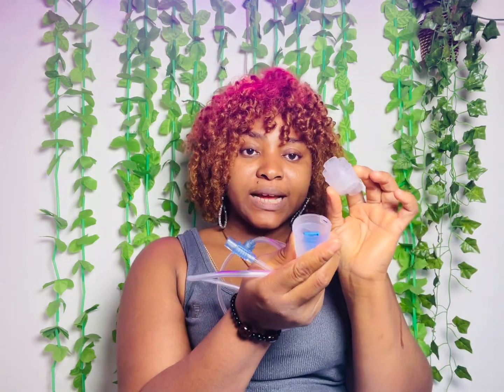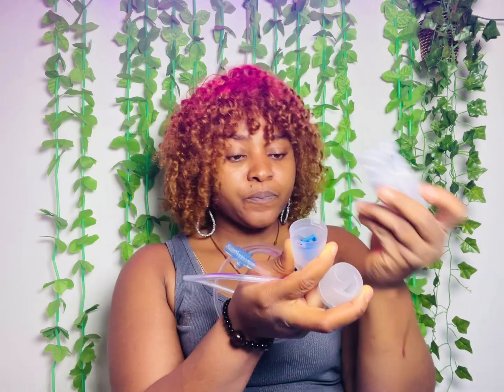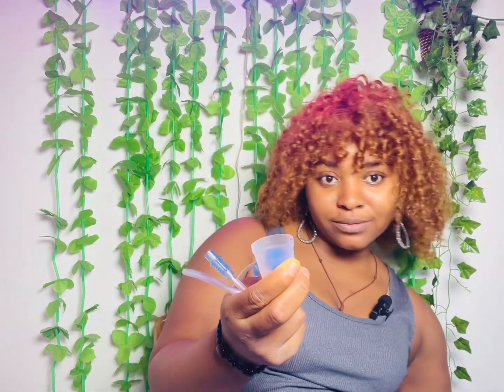When you're done opening it, you are going to insert the medicine that you want to use. When I say medicine, this is what I mean. One of these. It doesn't come with this pack of aerosol; you have to get it separately, whatever brand you want to use. You open one of these and put it inside here. There's something inside, don't remove it, that's a filter for this. You pour the medicine inside here, and then you cover it.